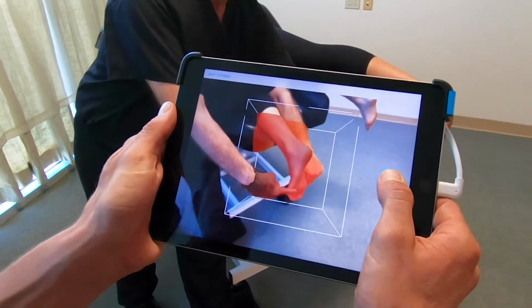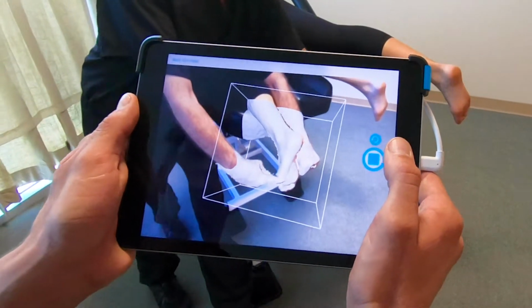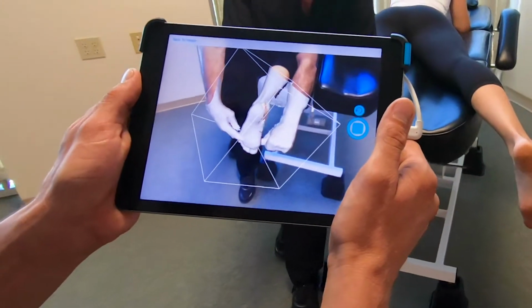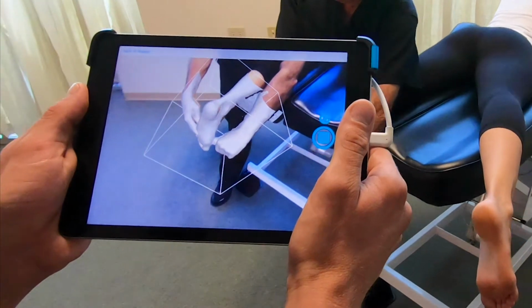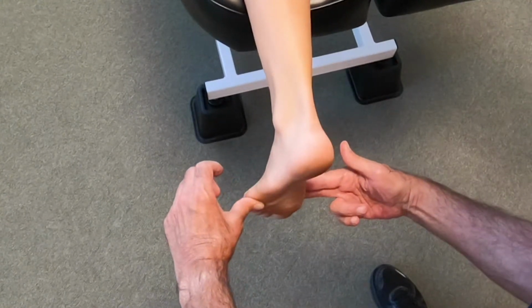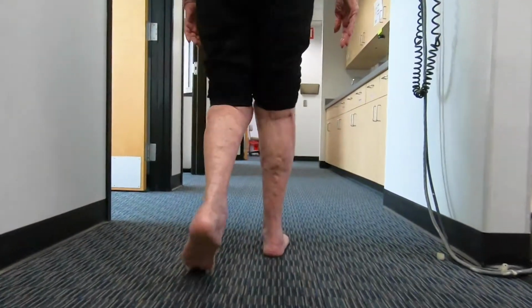Digital casting offers an exciting new breakthrough in our ability to capture the image of the patient's foot and ankle for fabrication of the Richie Brace. In so doing, we cannot forget one very important concept which we learned many years ago when we launched the Richie Brace. Proper positioning of the patient during the casting procedure is critical to achieve a correct alignment of the Richie Brace and optimal fit for an optimal patient outcome.